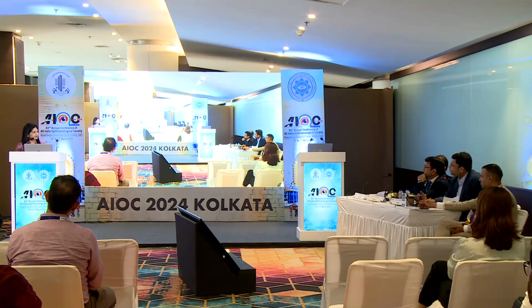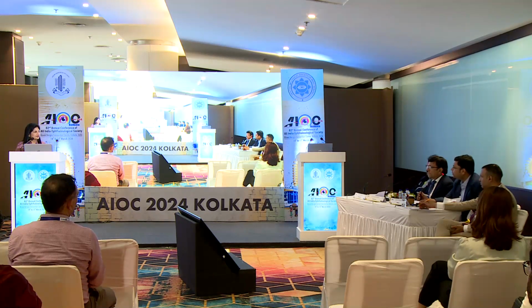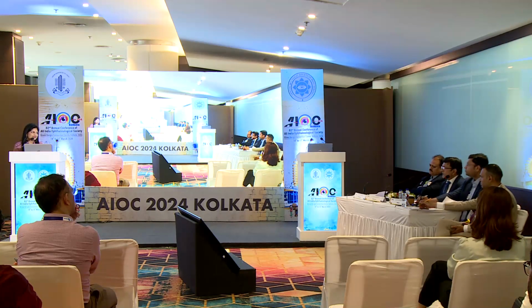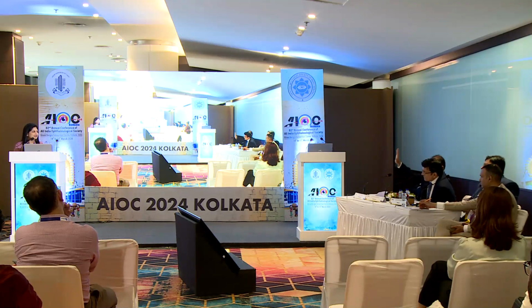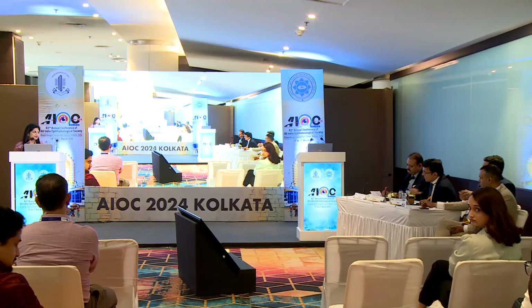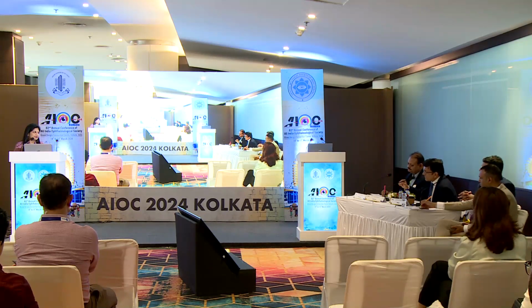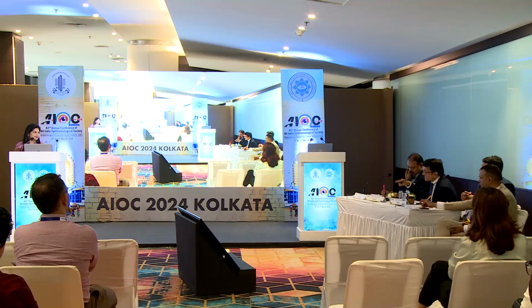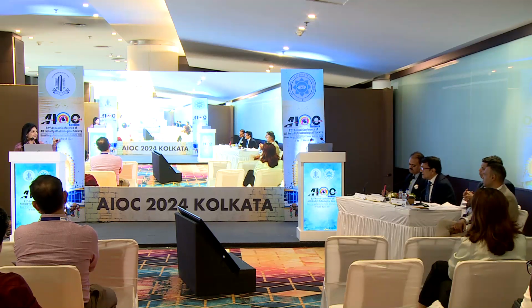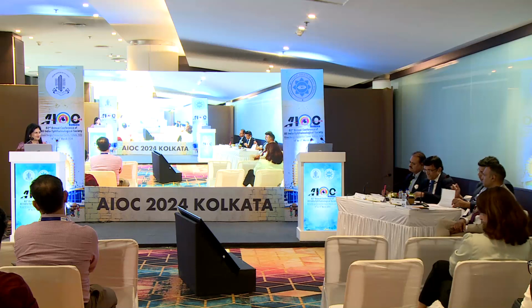It's a line scan. So I think en face would be a better option, because as sir is saying, you would not be missing any in-between lesions, because those again will be significant. En face will give you a uniform view. So you can have an en face of every layer, and on that, when you plot it out, you can even get that image and put it on ImageJ, and you can plot it and then compare it. Okay, sir. We actually did it manually instead of that. Yes, it's just a suggestion. Yes, sir. Thank you. Thank you so much.